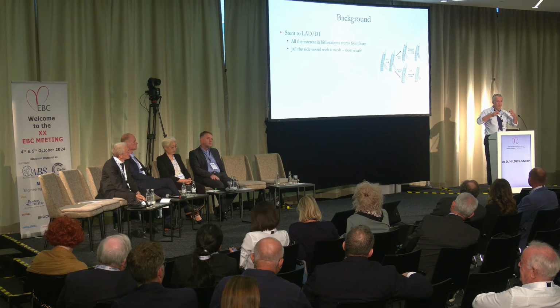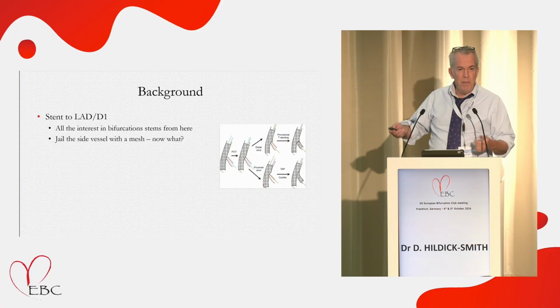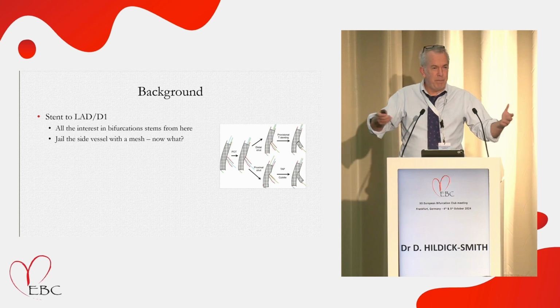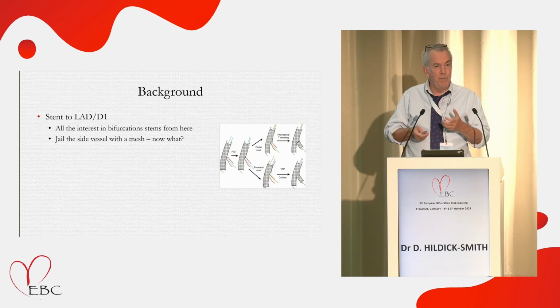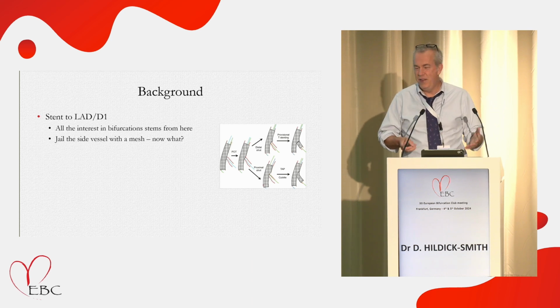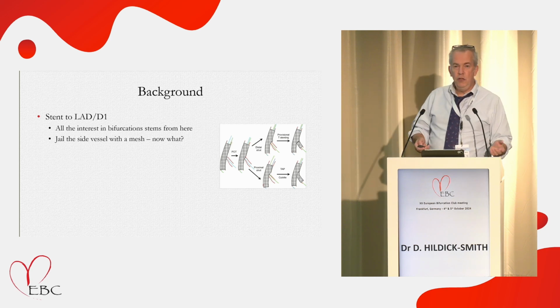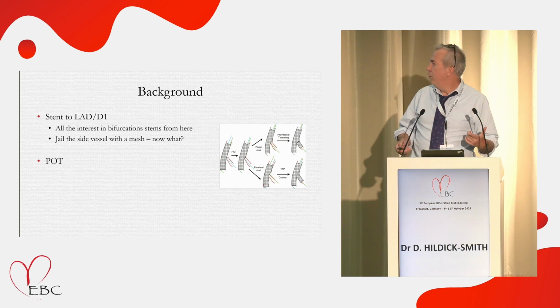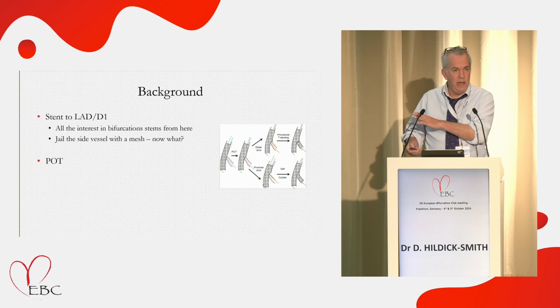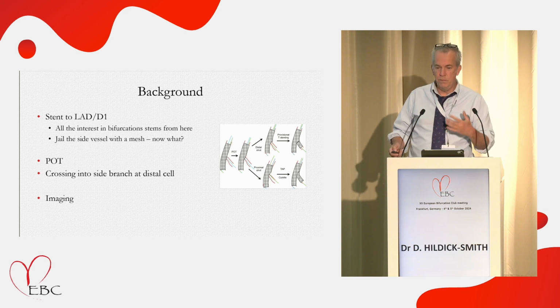It's a single cylindrical metal tube that you put down. Well, you only do one limb or the other. So then what do you do? You mangle it, and you expand it, and then you cross it with the wire, balloon the side, malapose it, and then push it back together. And then you think, no, it's all right, I'm going to stick with my balloon therapy, if you don't mind. That's the other way round of looking at this: we have spent ages and ages trying to refine how we approach the procedure.